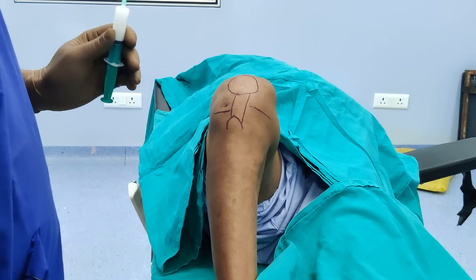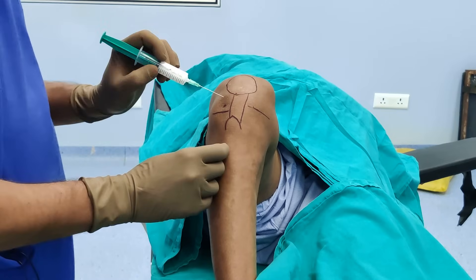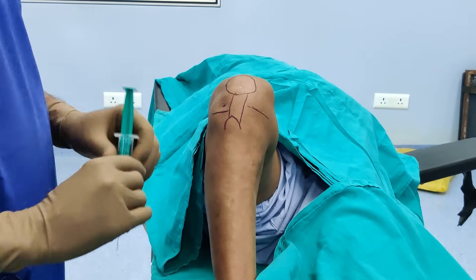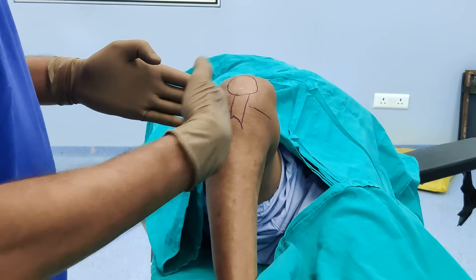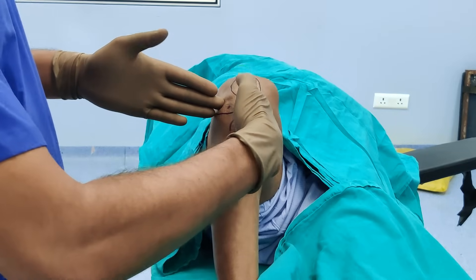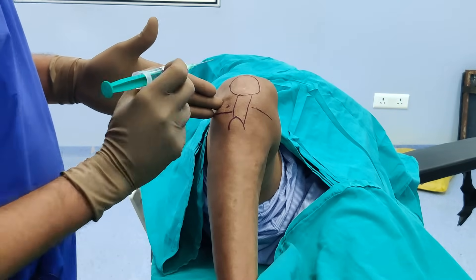The direction of the needle is extremely important. You don't want to be heading this way, and you don't want to be heading this way. If you draw a line — from the lateral side and from the front — you draw an angle. This is around 90 degrees, so you just need to be at 45 degrees.